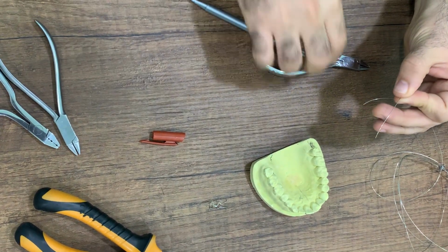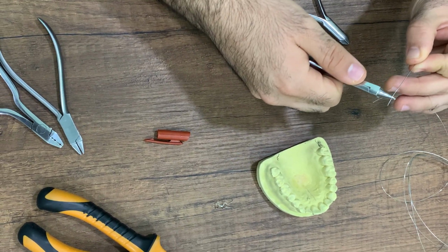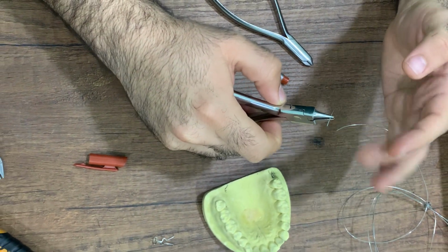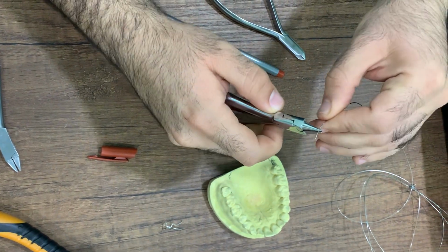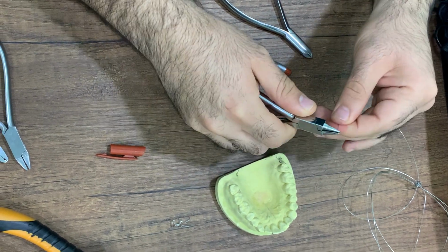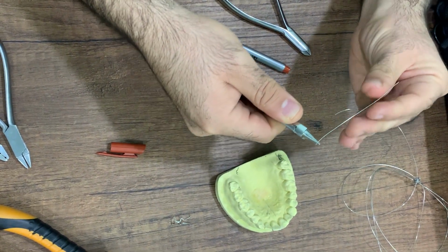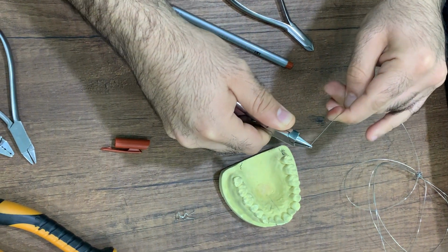Later, we straighten the wire. How to straighten the wire? With your right hand, hold the wire between the two pieces of the plier. With your left, non-dominant hand, pull the wire against the curve multiple times until it straightens. We repeat multiple times until the wire is straight.